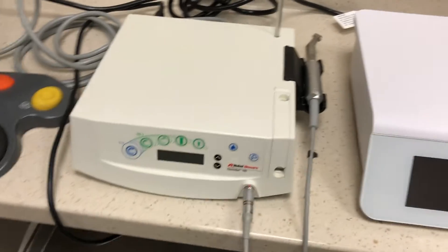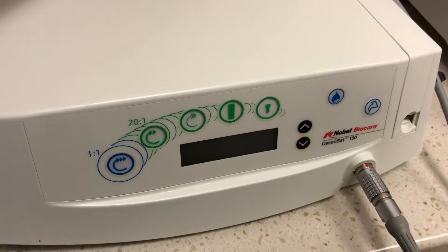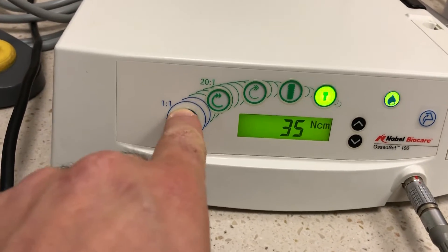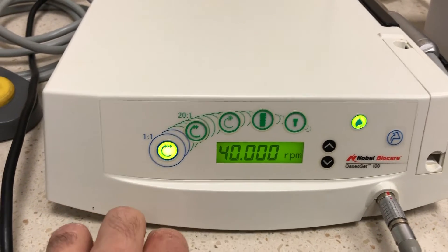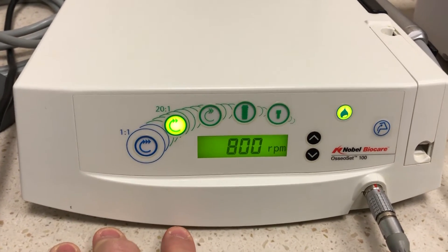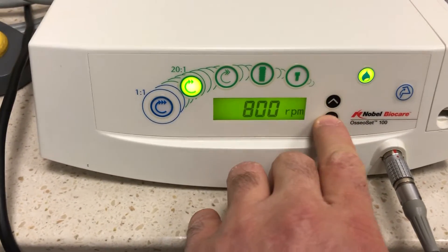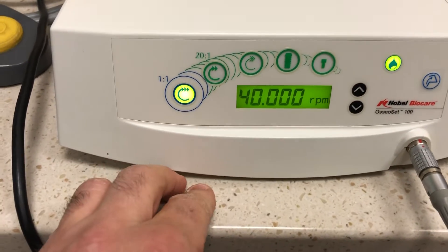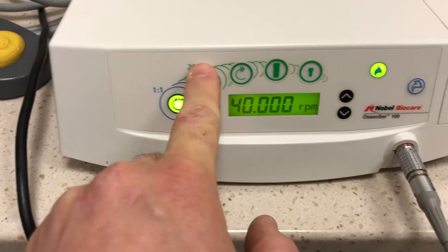Let's start off with both of these. The Osseoset 100 is very simple — it has an on and off switch. You turn it on. You've got a one-to-one motor setting; if you use a one-to-one it'll tell you it's 40,000 RPM. If you're using a 20-to-one, it'll tell you a different RPM and you can play around with that. You can switch it down to, say, 500, and the one-to-one setting is adjustable as well.